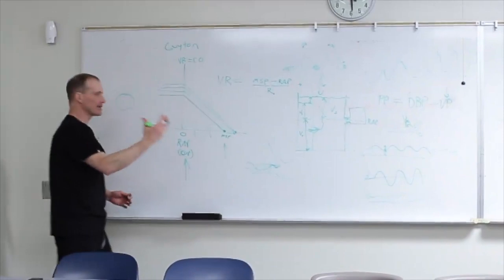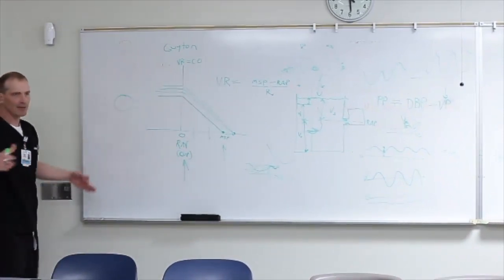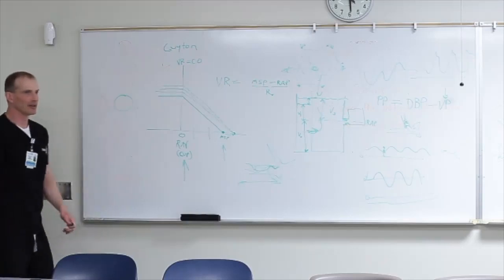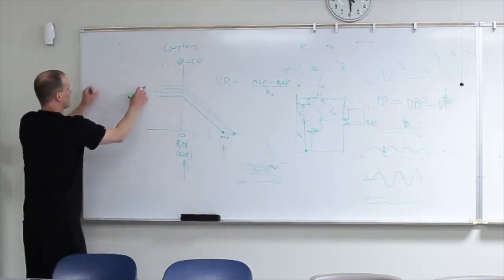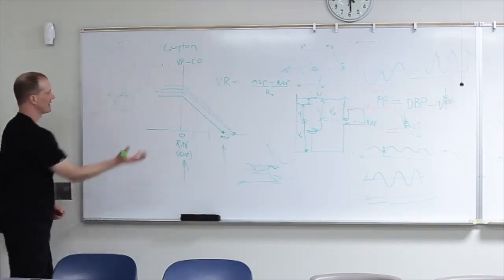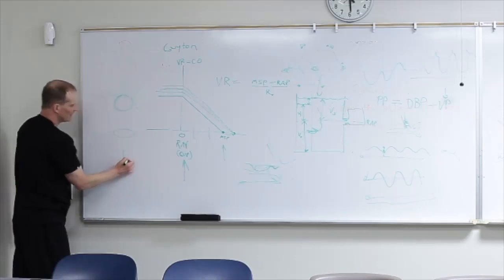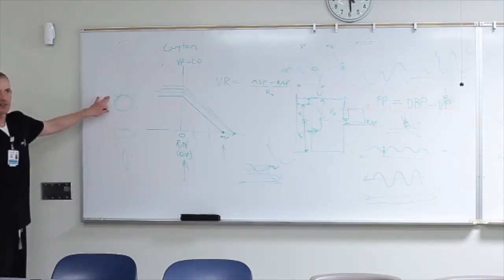and then when you're in this cross-sectional dimension, slide it back and forth along the length of a few centimeters of the vessel. Up here it's going to look like this as the three hepatic veins come in, and anywhere else it's just going to be a circle. But it can look like this. The anatomy can be kind of funny.